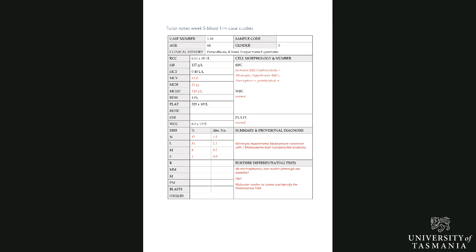This incidental finding is telling us that it's not expected. It's not what we're looking for, if you like. Now, for the calculations for the MCV, remember that the calculations here are taken from the haematology analyzer, and because the analyzer doesn't round numbers up or down the way we usually do when we calculate, there could be slight differences in what I've got here to what you've got.